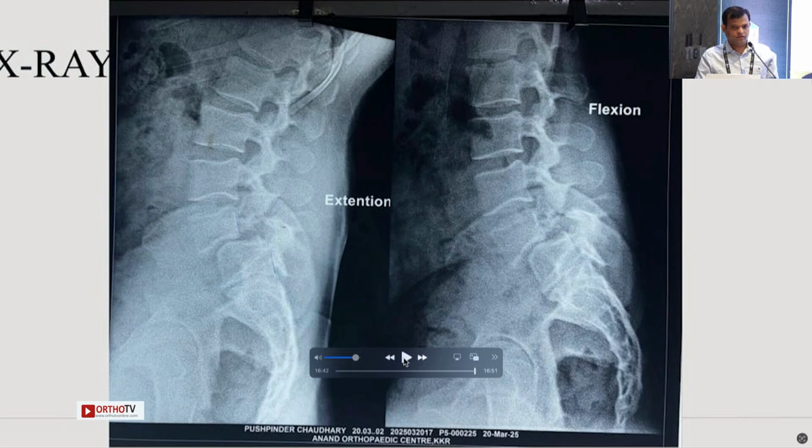Definitely it's more accurate. And the best part is the planning. The way you want to plan and do your surgery, you can execute it to the same plan. So biomechanically you can also take advantage, because you can take the maximum length of the screw. In a dysplastic pedicle, you can plan the maximum length and the maximum diameter of the screw, and with the help of the robot you can maintain that navigational integrity. And you can take anterior purchase. So in high-grade listhesis, you are taking the maximum biomechanical advantage of that particular screw.